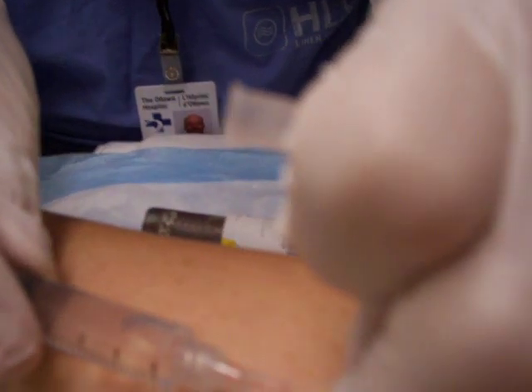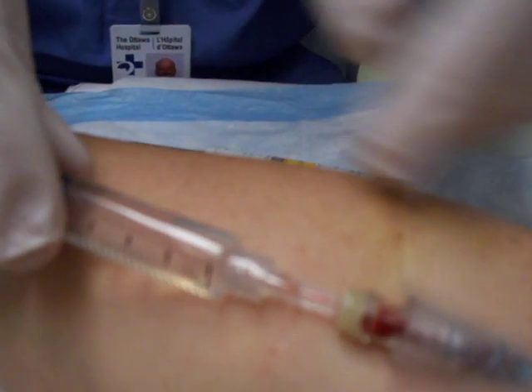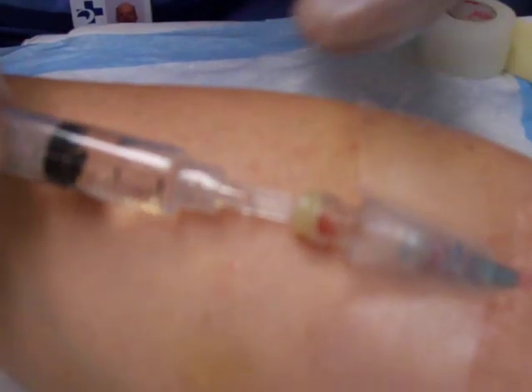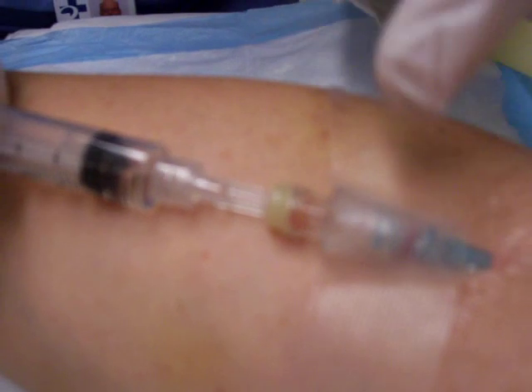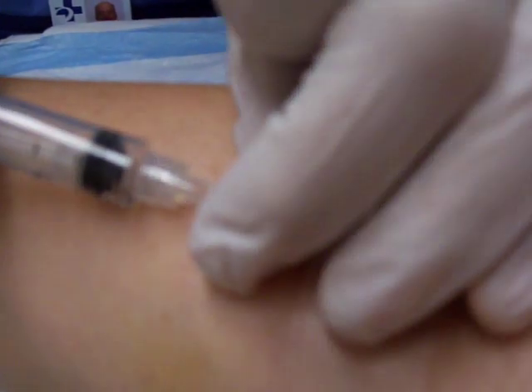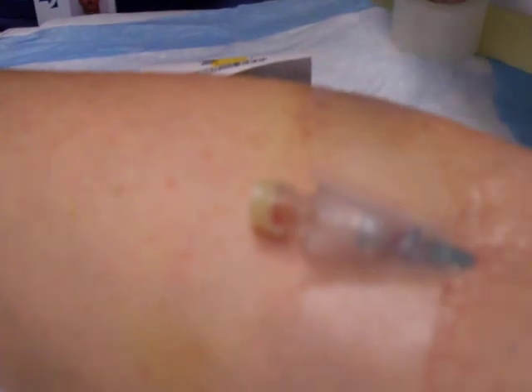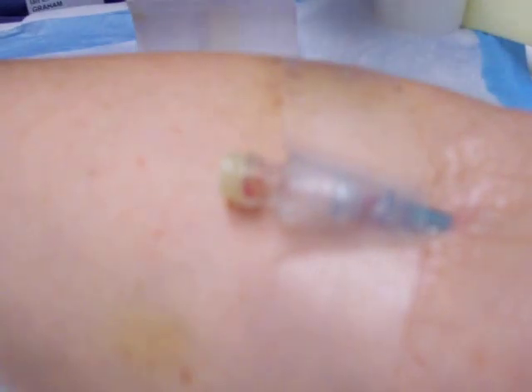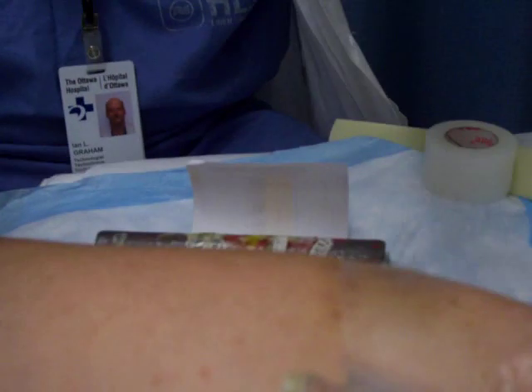Just to make sure that this is not going to clot, we give it a good flush to get the material in properly. This is what's called a saline lock because it basically is locked now — it will prevent blood from coming back because there's a little reservoir of saline in here, so it prevents that clotting. It keeps it open, in other words.